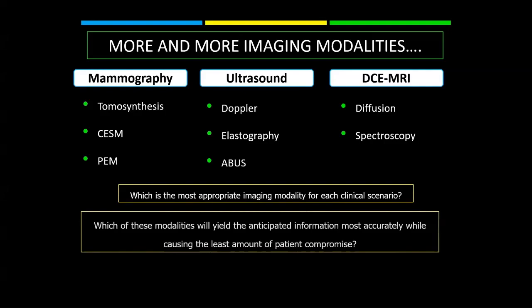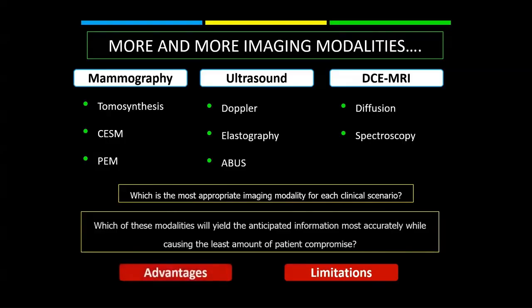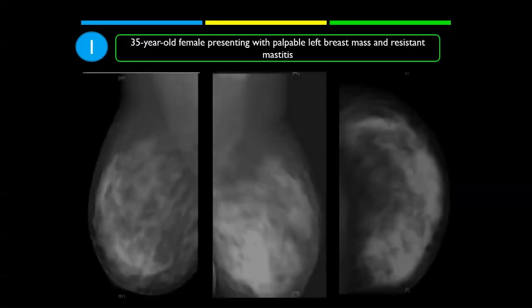And I think to do this, we should be aware of, or acquainted with, the limitations of these imaging modalities, even far before we know their advantages. And from this perspective, I'm going to discuss with you today the inflammatory breast disorders.